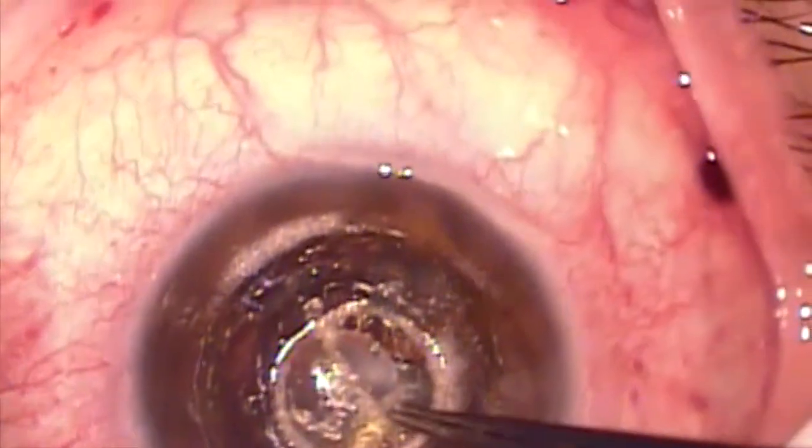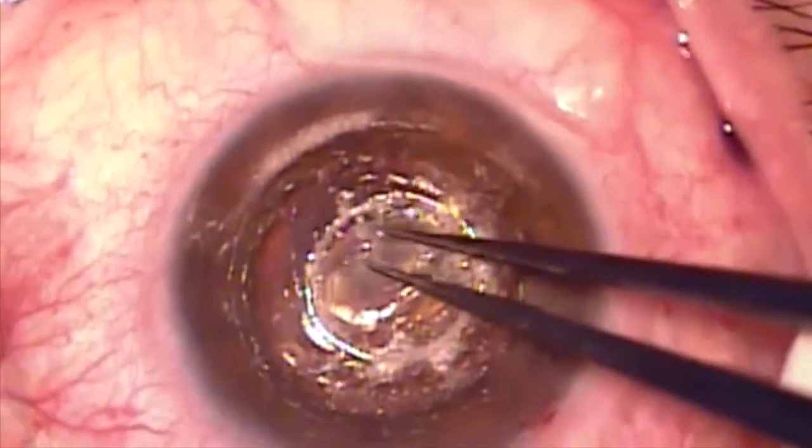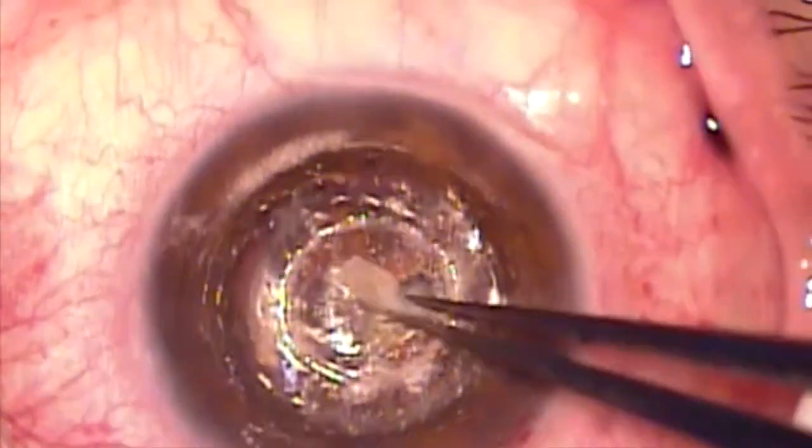The femtosecond laser is used to create an 8.0 mm diameter corneal pocket as well as a 3.5 mm trephination incision. 0.12 mm forceps are then used to remove the diseased disc of corneal tissue.